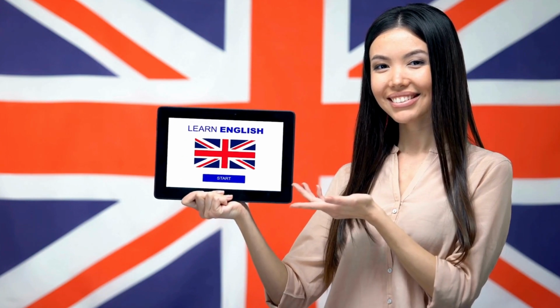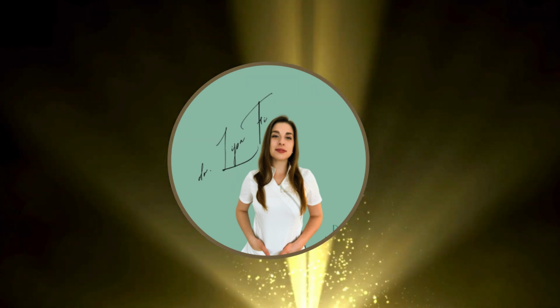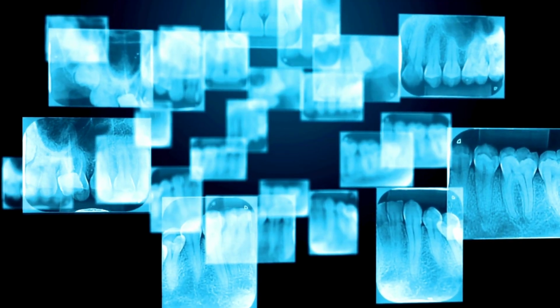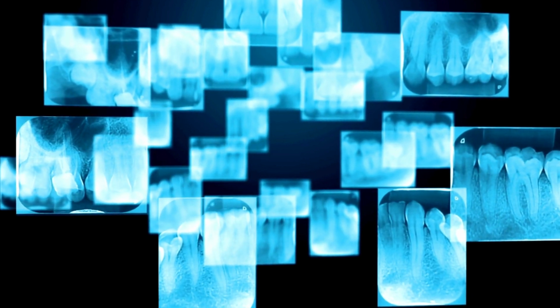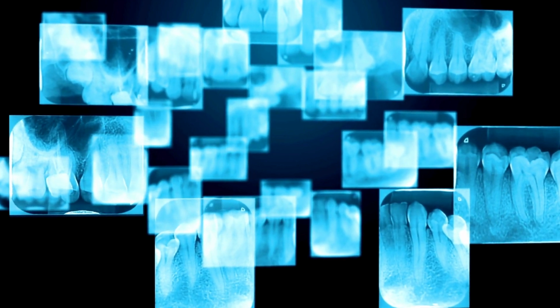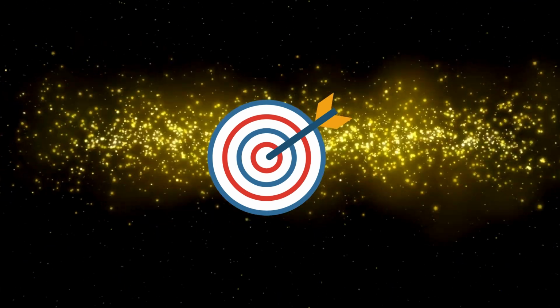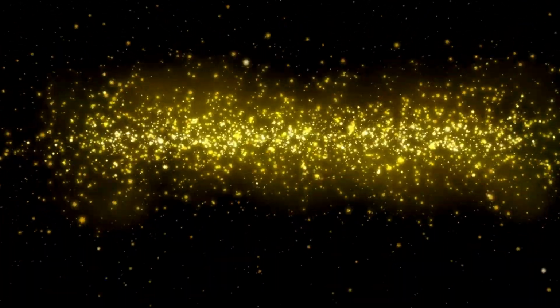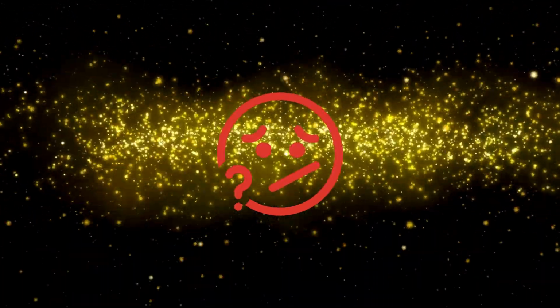Before we dive into the short video, let me give a brief intro for those unfamiliar with me. I'm a dentist working on my doctorate, specializing in forensic dental medicine. Fun fact, age estimation can actually be done based on panoramic X-rays. It's pretty accurate for kids, where we can pinpoint age precisely. However, in adults, the variations are a bit wider, so we're talking about estimates rather than exact determinations.